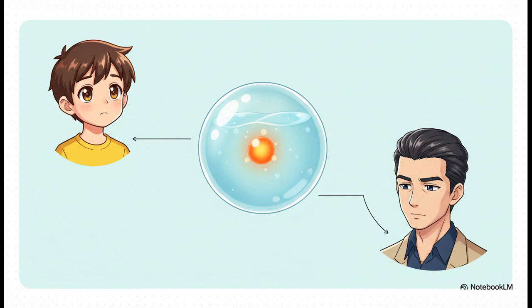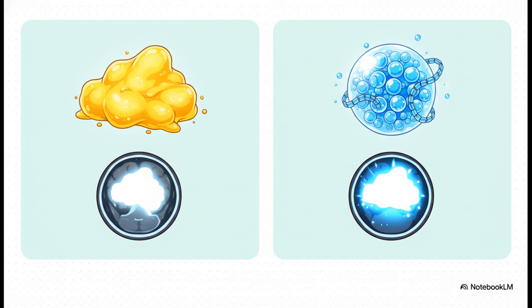If you see an image that looks like a cyst with a nodule, basically a fluid-filled balloon with a solid little ball inside that lights up with contrast, it really just boils down to one question. How old is the patient? If it's a kid, your prime suspect is a juvenile pilocytic astrocytoma, or JPA. If it's an adult, you're almost certainly looking at a hemangioblastoma. Simple as that.